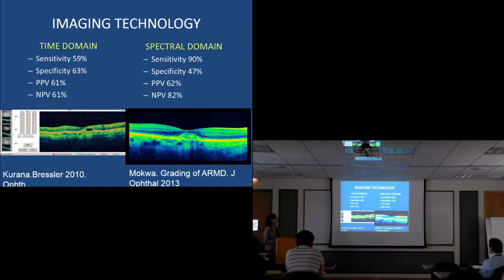And these patients were included in studies for treatments and labeled as failures because, why was that fluid still there when we were treating them with medicine that should absorb it? And it actually was that there was no fluid there to begin with, and now with better imaging we have that. So just to highlight the difference between what time domain is, what spectral domain is, both very helpful, but we're excited for the next breakthrough that's probably going to come from someone in this room.